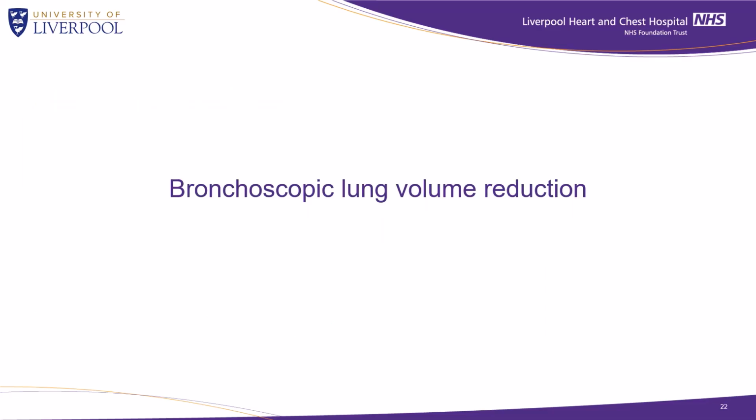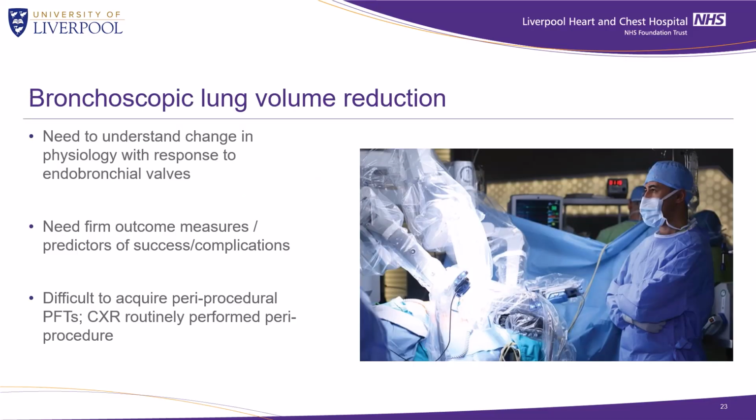We've also started to branch out into other areas of assessment. We've started to look at cases of bronchoscopic lung volume reduction. So we need to understand the change in physiology in response to endobronchial valves. There is a need for firm outcome measures and predictors of success and complications in these procedures, and it can be difficult to acquire peri-procedural pulmonary function tests.